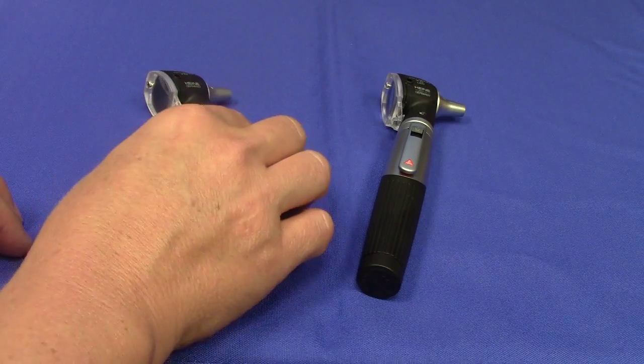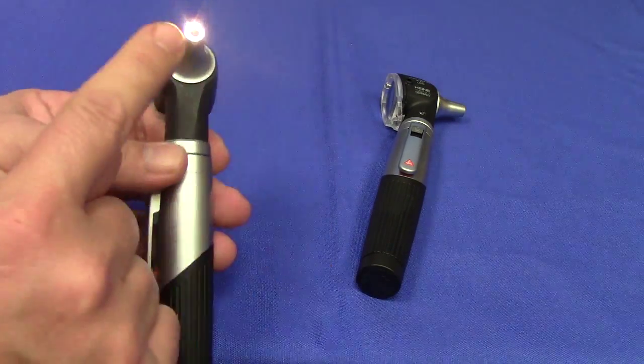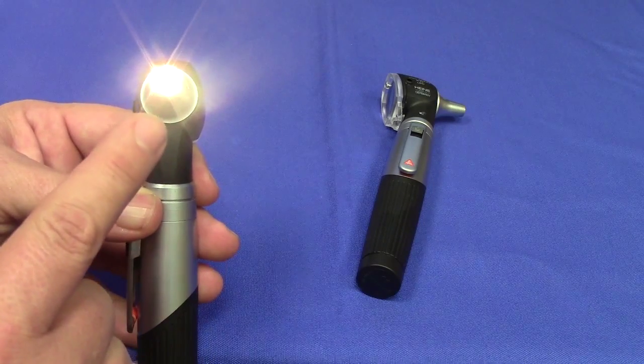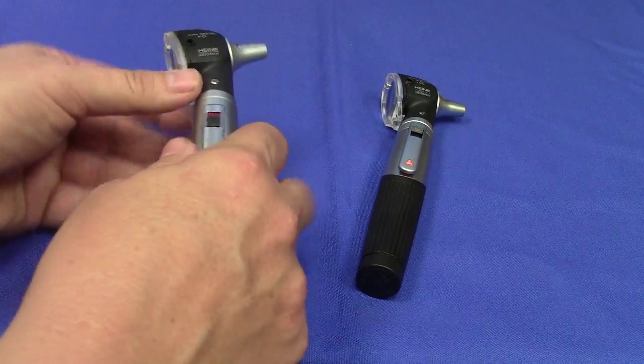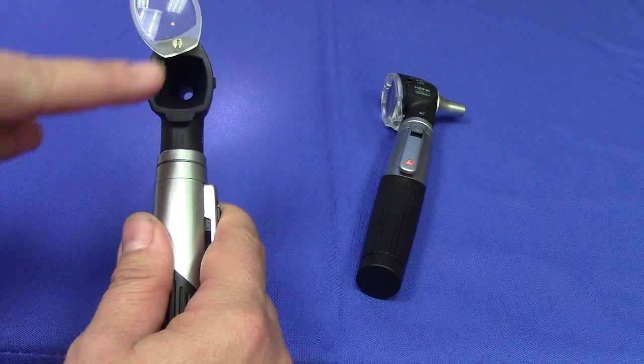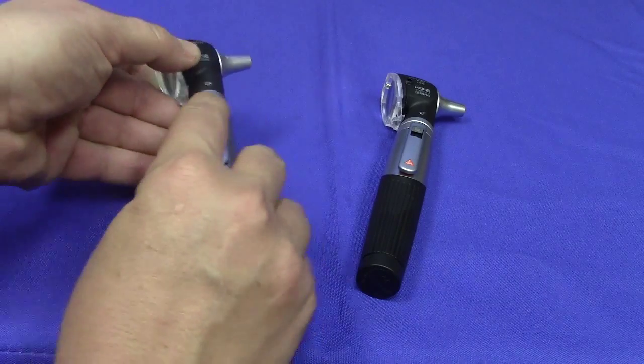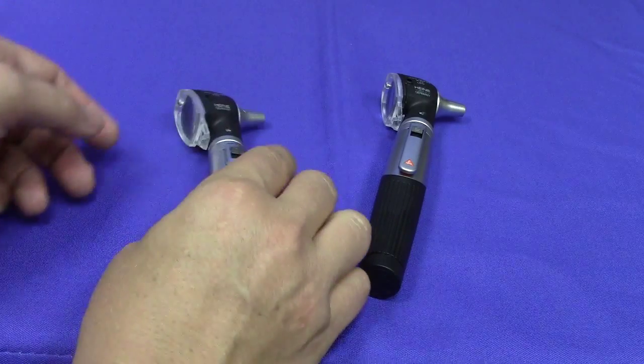In contrast, the two Heine fiber optic models deliver illumination through the speculum via a fiber optic bundle. The advantage of the fiber optic technology is that it provides a completely unobstructed view of the ear canal and tympanic membrane through its lens, because the bulb can actually be located on the floor of the eyepiece.